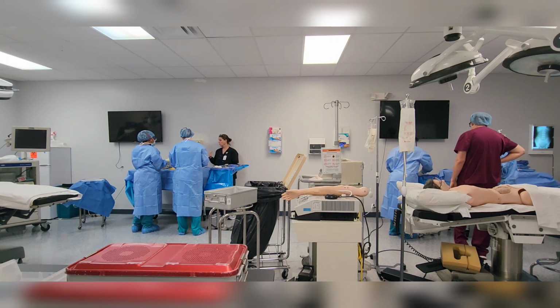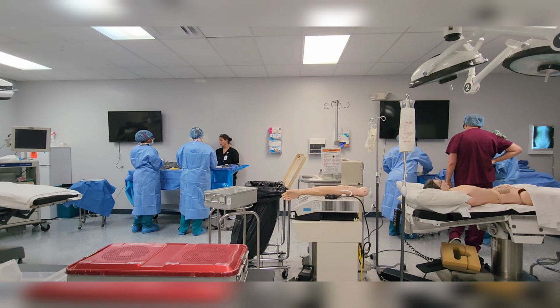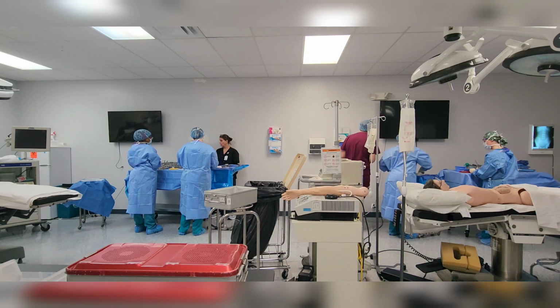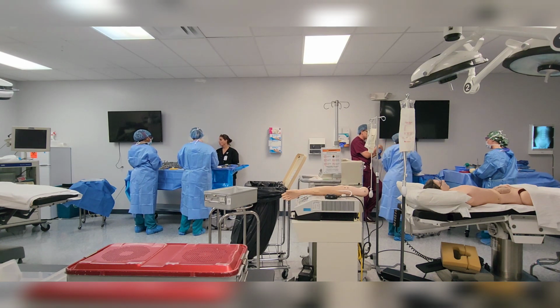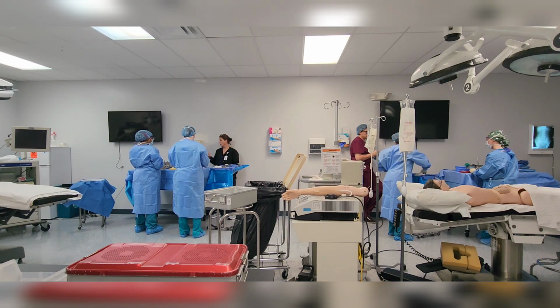The reason why is we're going to be taking a stapler, a GIA stapler or a TA stapler, and we're going to go across the appendix. Then we're always going to invert the stump. You have to invert the stump. When we pivot, the concept's the same. Then they're going to suture it, and it's going to be a long suture, like Chrissy said. Go with what you're comfortable with. So once it's organized, then do that.